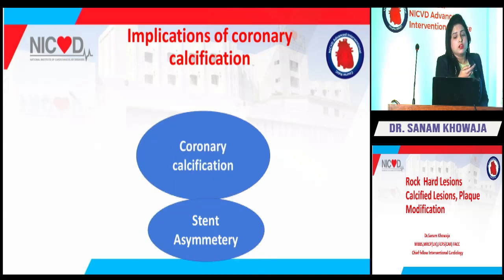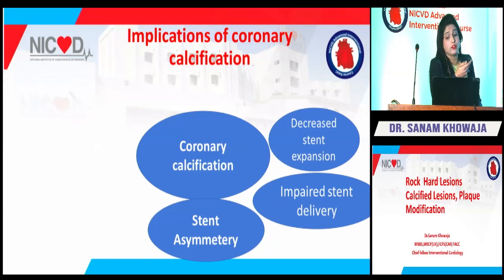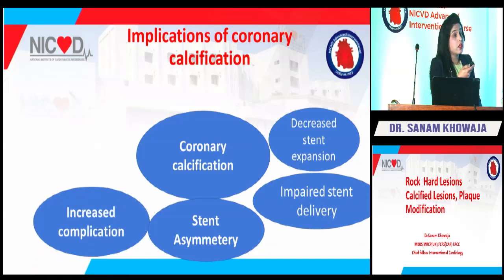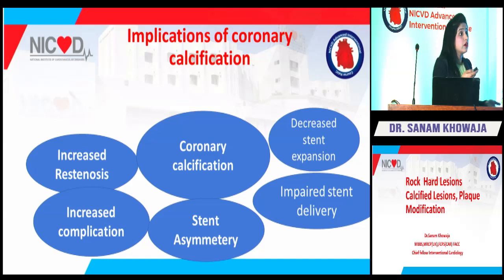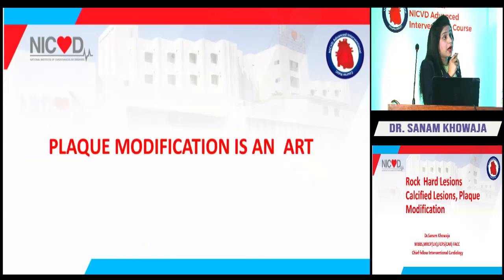What's the problem? The point is that coronary calcification is not only causing a problem in the stent deployment; the inadequate deployment, the inadequate delivery, and of course the complications are all increased. So whenever we have a calcium, we have a problem with stent expansion and delivery. We have increased rates of complications, which include perforation, dissections, and of course the increased rate of post effects, the restenosis and the thrombosis. So a good plaque modification, excellent preparation of a calcium bed is an art for an interventional cardiologist.